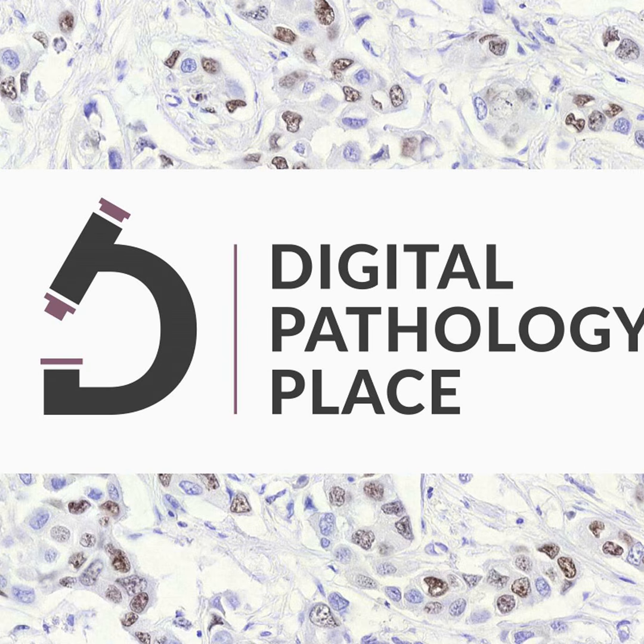And then we can go to level 3 and expand our horizon to non-gynecologic samples and advanced AI. So the transitioning to non-gynecologic, it has begun, but it has challenges regarding diverse specimen preparation and unique characteristics. So check out how these cytology specimens look, and they are challenging for the human eye. If they are challenging for the human eye, then they're going to be challenging for computer vision. But what is happening right now in this level 3, there is automated quantification and quality control.